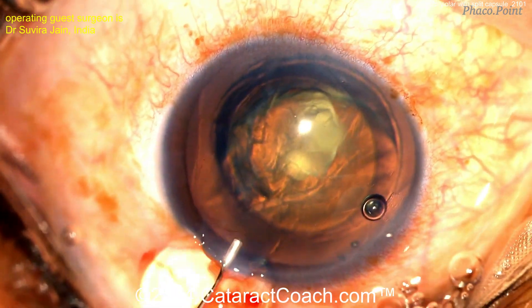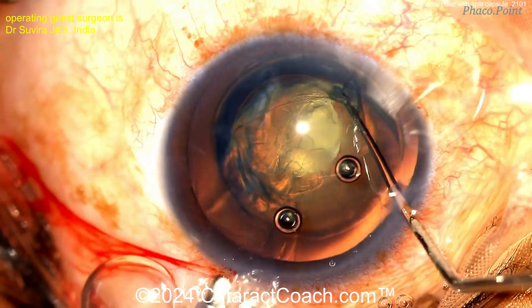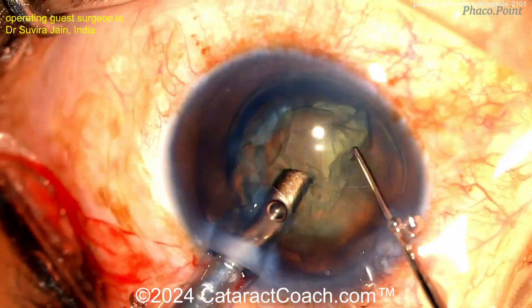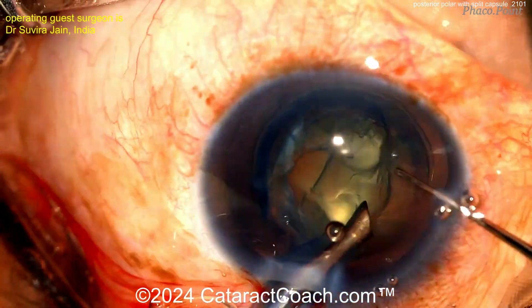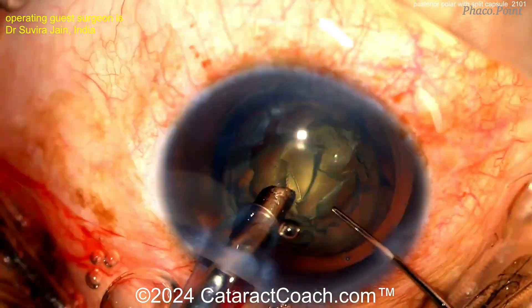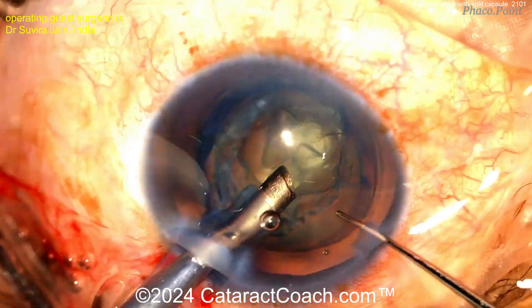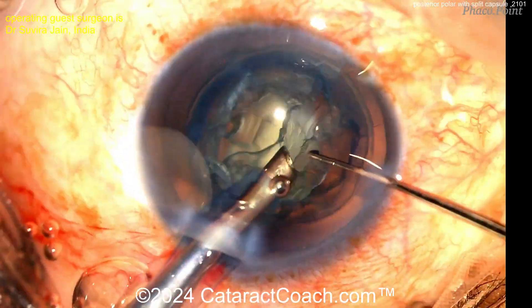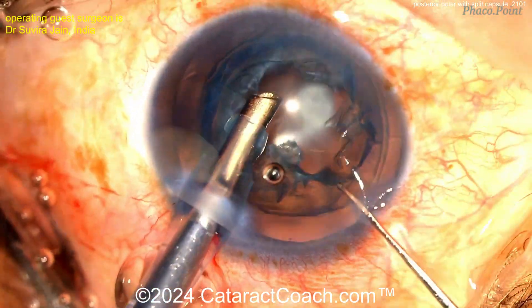We've sped the video up a little bit just to be efficient here. More viscoelastic, and now using the phaco probe and a chopper to just get that endonucleus out of the bag. You don't need much phaco power — it's pretty soft here, not a lot of nuclear sclerosis. Just really titrating that vacuum with the phaco foot pedal to get that endonucleus up and out of the eye. There's the endonucleus.